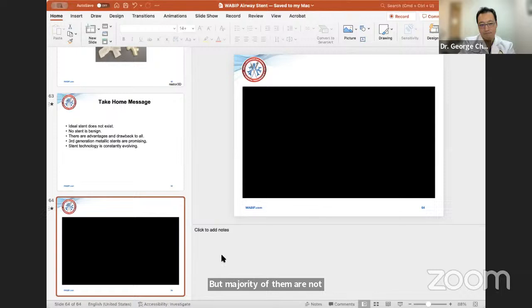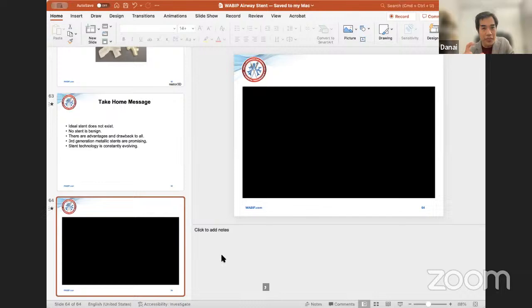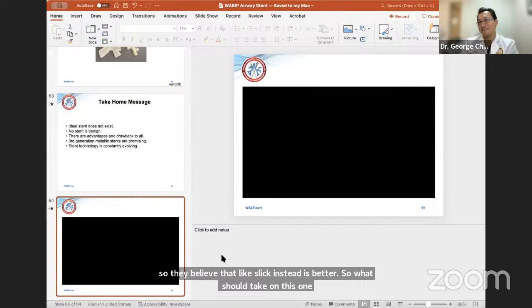All right, so we dial to the second question, and I selected the one related to metallic stent. Okay, so let's see. What are the pros and cons of using a fully covered metallic stent in a benign disease, right? There are some experts opposed to using those kinds of stents in benign disease, and they believe that silicone stent is better. So what's your take on this one, Dr. Cheng?